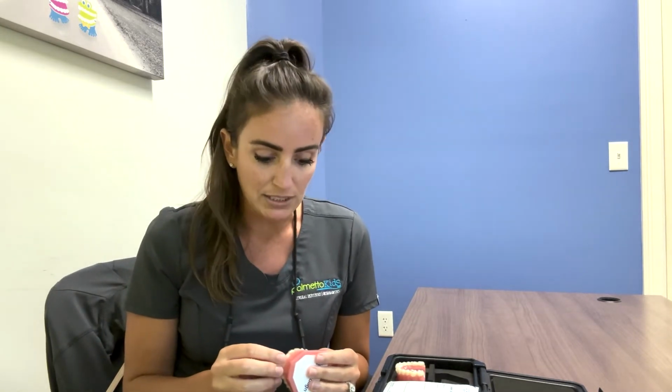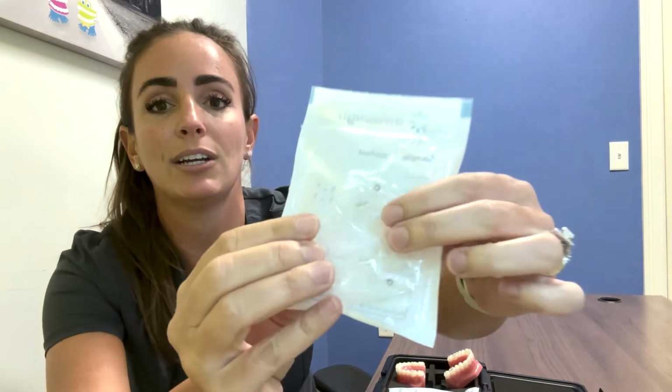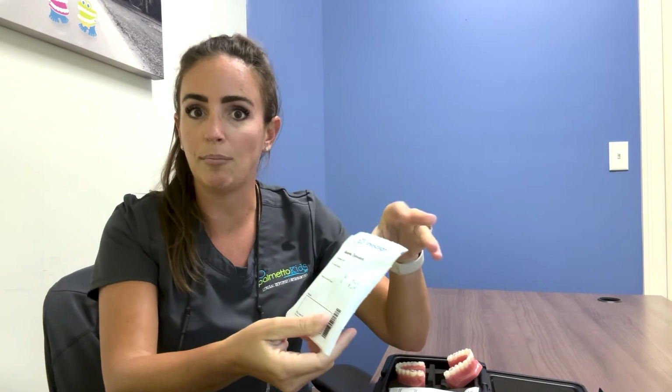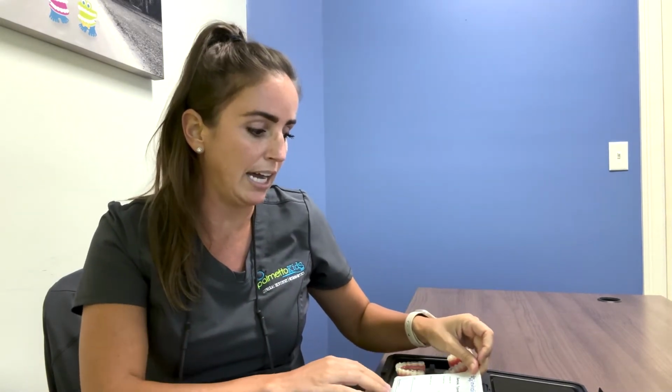So if we decide that you are a good candidate for Invisalign, or your child is a good candidate for Invisalign, then the very first step would be to take a scan of the teeth. That scan is what I can submit through the Invisalign doctor site to set up your treatment plan. Once I've spent the time setting up your treatment plan, we'll receive back a number of trays. They come packaged in little packages like this. So you can see upper and lower. Everything is labeled with the upper and lower and the number of tray, just so that there's never any confusion of which one you actually have.